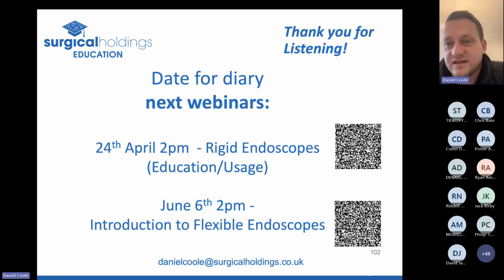In my opinion, yeah, there should be at least some pre-cleaning, because they could be covered in saline, as we mentioned, and that can obviously cause problems to the instruments in terms of them corroding, binding up. So yeah, if that's possible, definitely yes. If not, it is also possible that there could be some sort of pre-cleaning treatment. I've seen things like humid bags where you keep the instrument humid and make sure that residue doesn't dry on them. So that's also important.